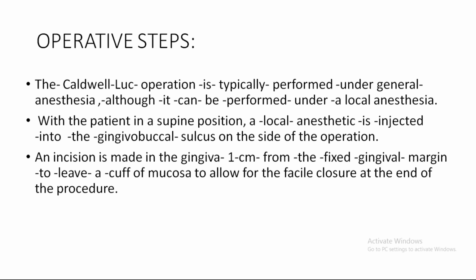The Caldwell-Luc operation is typically performed under general anesthesia, and although it can be performed under local anesthesia, patient compliance will be better in general anesthesia. When the patient is in supine position, local anesthetic is injected into the gingivo-buccal sulcus on the side of operation.